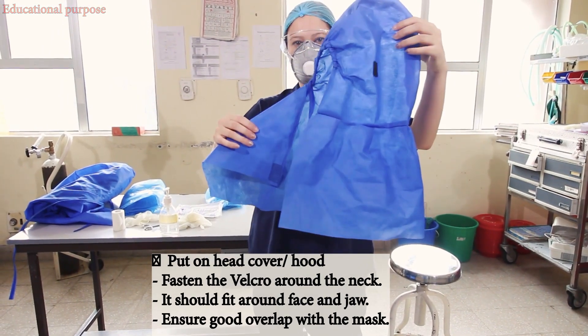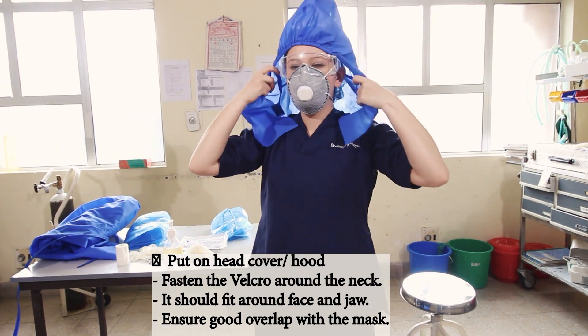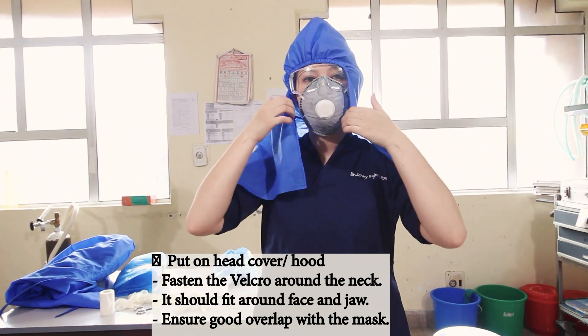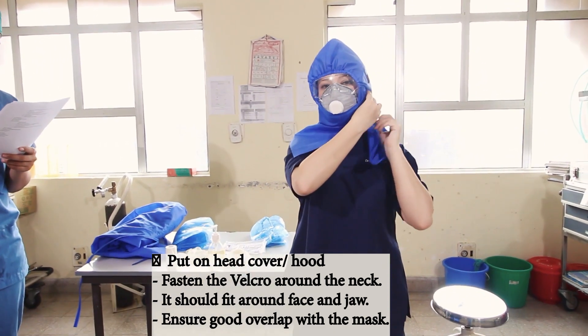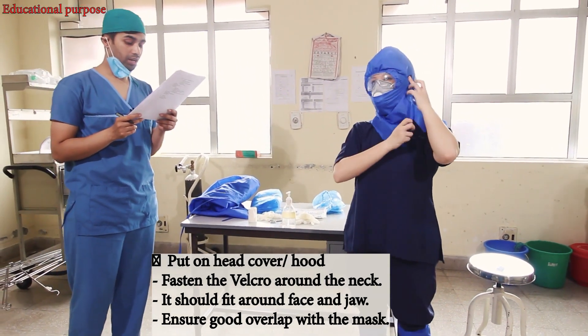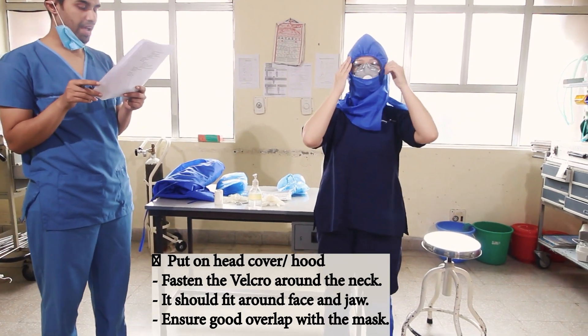Now we'll put on the head cover or the hood. It should fit around the face and the jaw. Ensure good overlap with the mask too.